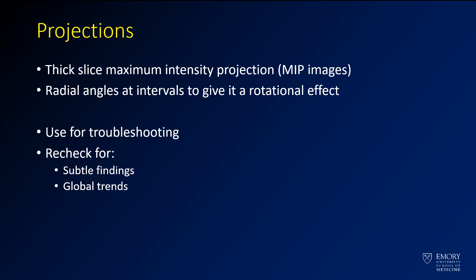As part of almost every MR angiogram, you're going to have some projectional images. These are thick-slice maximum intensity projection images that the technologists have created to give you a general overview of the vessels. Many times certain vessels will be cut out so you can see only the anterior circulation or the posterior circulation at one time. These will be projected at radial angles to give a rotational effect as you scroll through. I tend to use these for troubleshooting — I'll recheck for subtle findings, for example a subtle aneurysm that I missed, and also look for global trends such as whether one cerebral hemisphere is less perfused than the other.